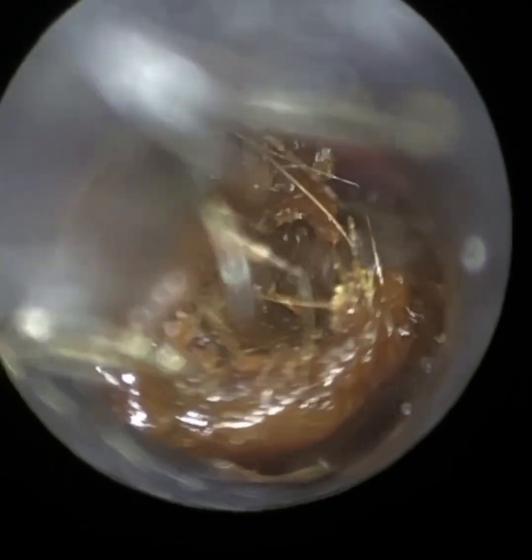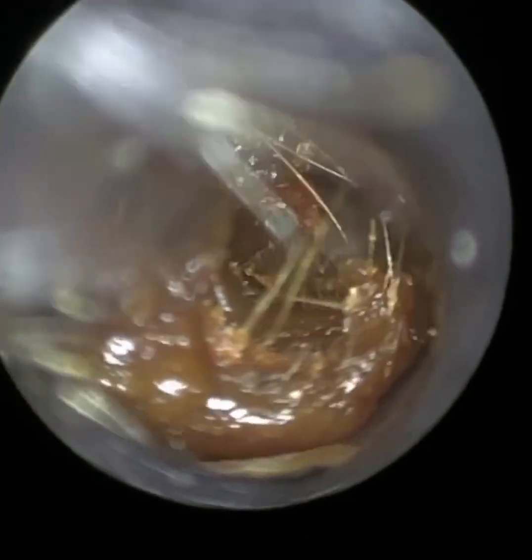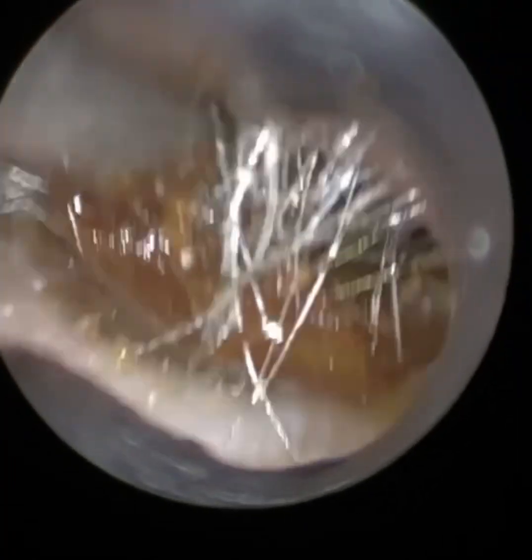I'm just coming away a bit more laterally and I'm just trying to manipulate the wax plug off the posterior canal wall. I'm just giving it a little wriggle just to detach it and slowly now coming away. The ear canal, because it's narrow, has trapped this wax and closed upon itself, but we just managed to tease it through.